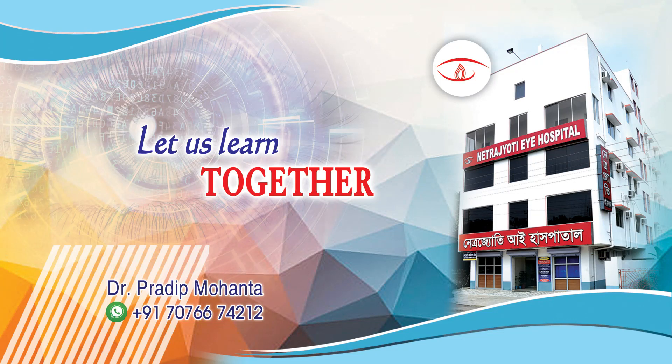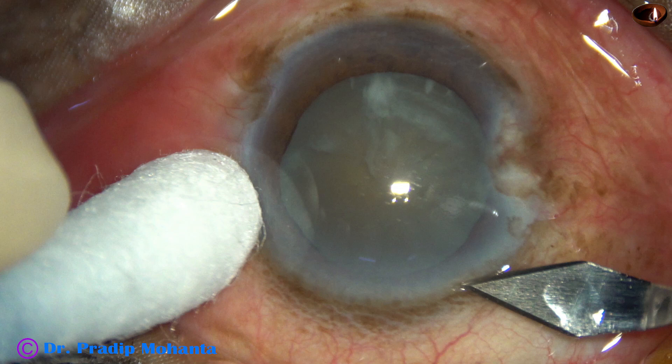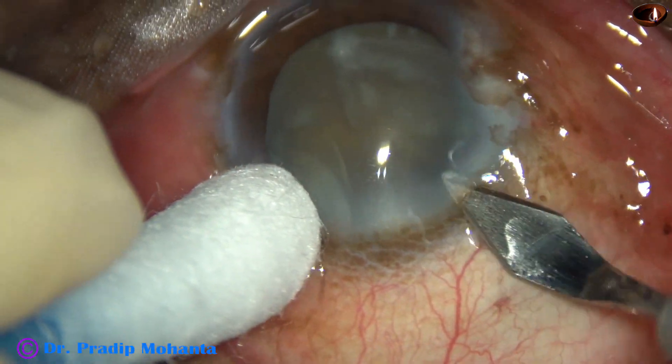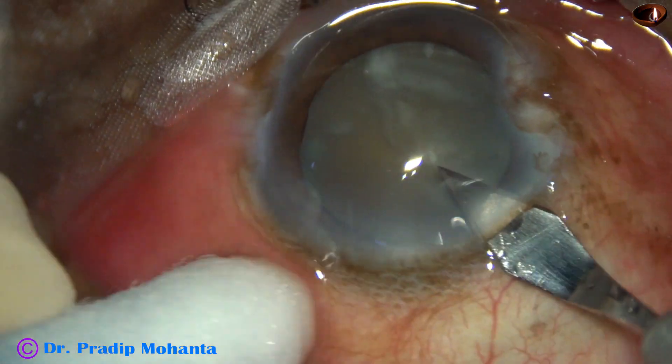Friends, welcome to my workplace at Ranagha, West Bengal, India. This is the most elderly patient I have operated on. The patient is 104 years old. Let us observe this surgery.